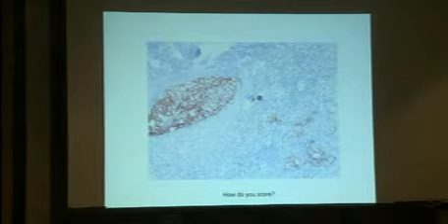I just wanted to remind you that the only cells where you do the scoring are the invasive cells, not the in situ. This is also something you have to be sure of when you are scoring your in situ hybridization, especially if you are doing FISH, because you will be in the dark. Only score on the invasive cells and not on the in situ tumor groups. Okay.